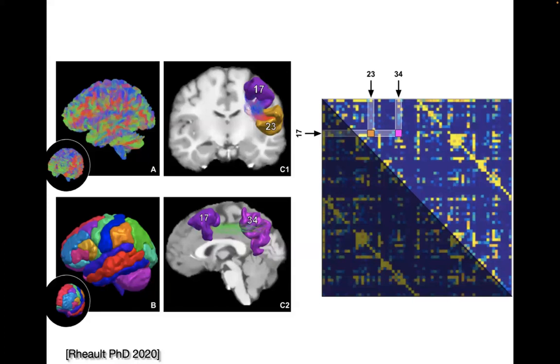And just to make sure everybody follows, between two parcels here, internally, we have all these tracks, so we have all the pixels. And so we can basically put any number here that we want. We could put the volume of the track, the count, the cortex touch, the FA if we want, the axial diffusivity, whatever we want in this.